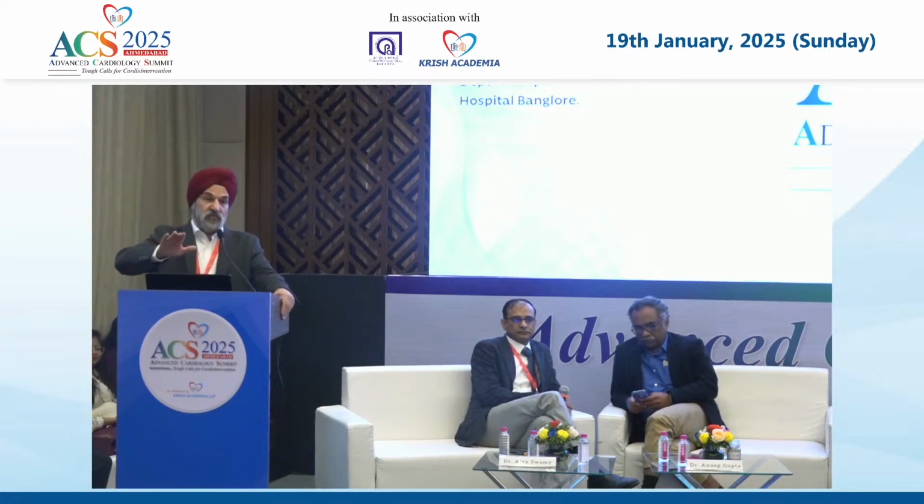To prevent microvascular obstruction, do you feel rota is better or orbital is better? So I think this question was very well answered by Ashwin sir in the morning. The particle size which orbital produces is nearly one third that of the rota. And so microvascular sludging is not seen at all with orbital atherectomy. That is why if you read the IFUs of the orbital, it is cleared even in patients who have LV function of 25%. But the speed of the rotation is less in the orbital compared to standard rota.